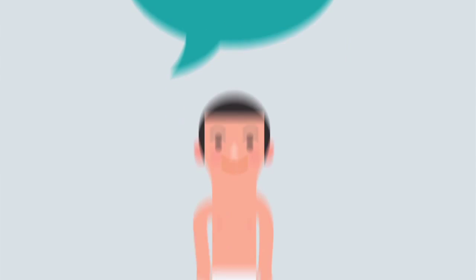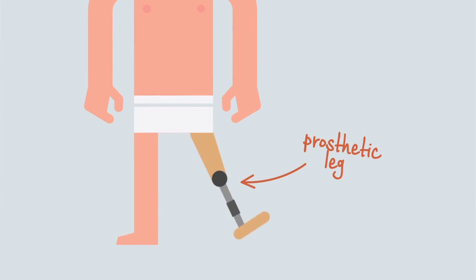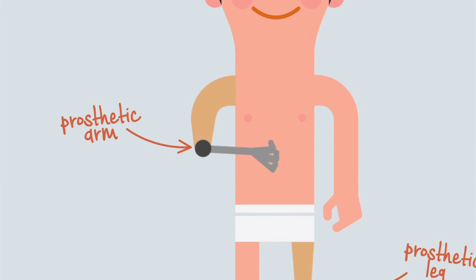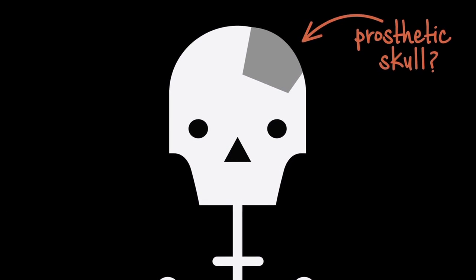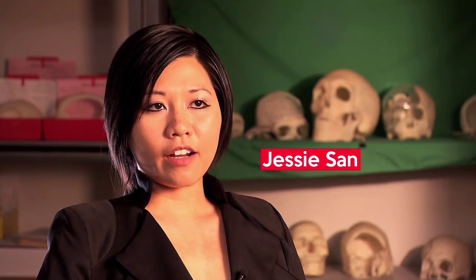When you say prosthesis, they think of a leg or an arm, but they don't really think about the skull. My name is Jessie San. I am the case manager at OsteoSymbionics.